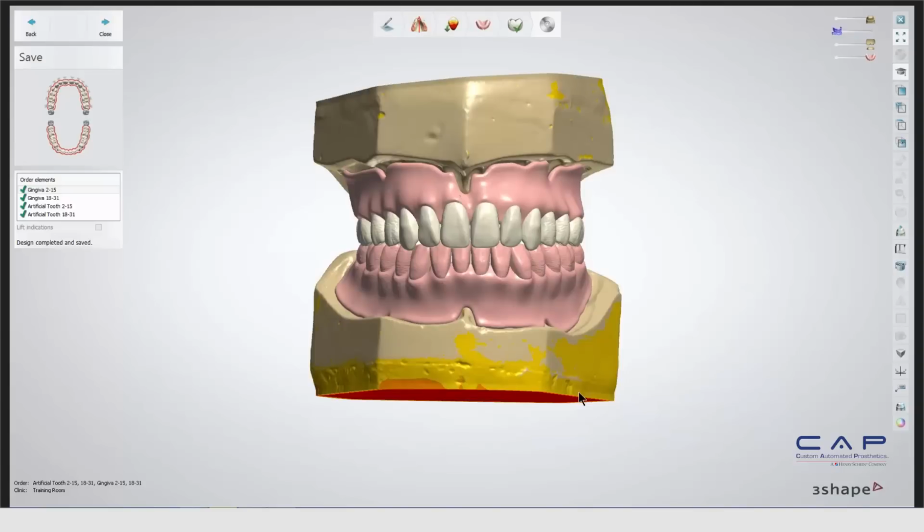So I'm very anxious to see if we could go ahead with that more powerful spindle and put in a wider diameter tool to do roughing really fast, like a 4 or 5 millimeter diameter, where normally the largest tool we put in a mill for dental is 2 millimeters for crown and bridge. So it's going to be about time, how long it's going to take. We've milled some bases in Roland. It's taken a long time. I don't think the Roland spindle would be efficient enough to do this on a regular basis. So we need a mill with a pretty heavy-duty spindle for this protocol.